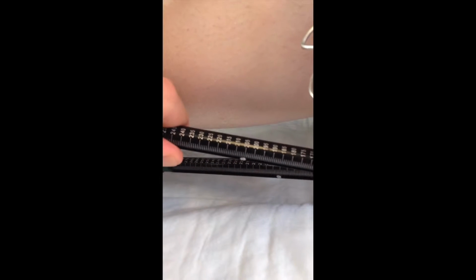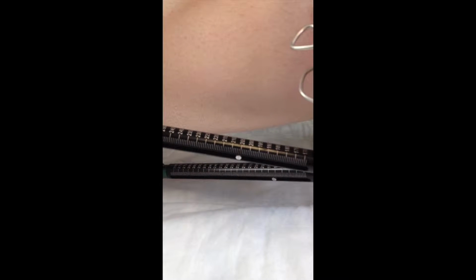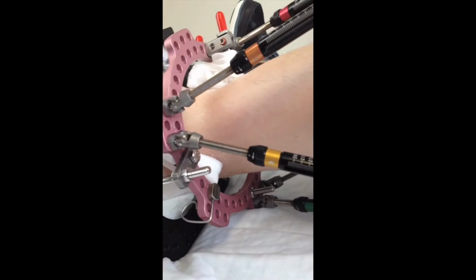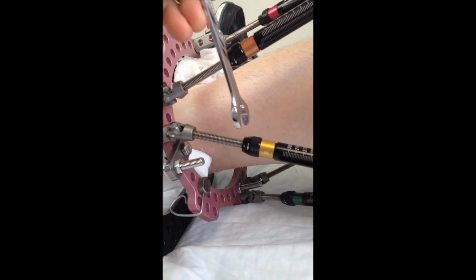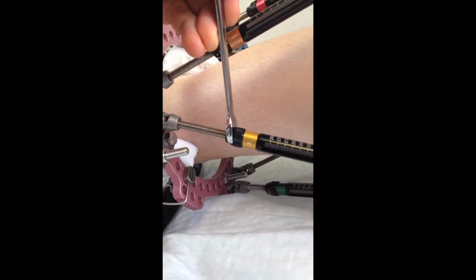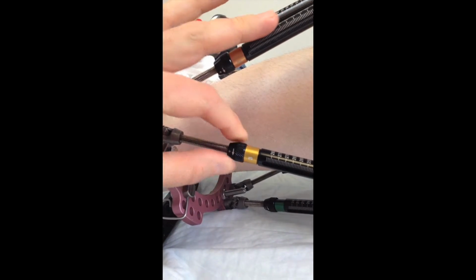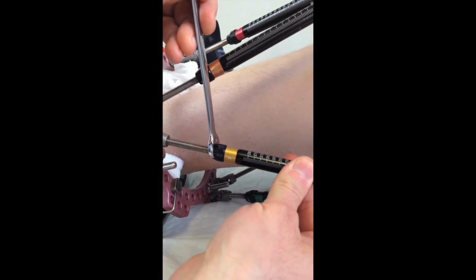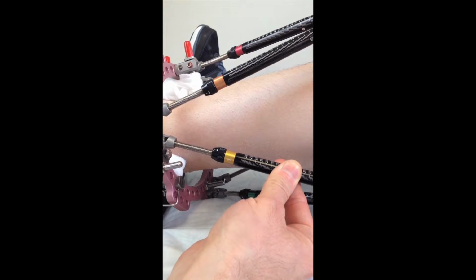This strut is on 206 and we want to move it to 207, but it's gotten quite tight, so we need to use a wrench. So let's look up here. This is the head of the strut right there, and you see the arrow, and the wrench actually fits right on there nicely. Instead of using our fingers, because it's too tight to move here, we'll use the wrench. I'm going to put the wrench here, hold the strut, and turn with the arrow until we get up to the correct number.